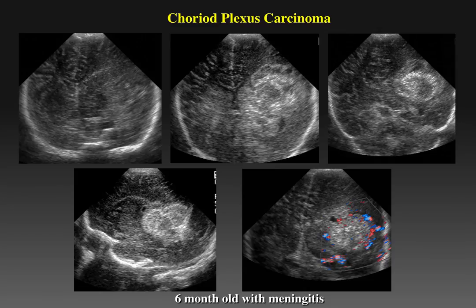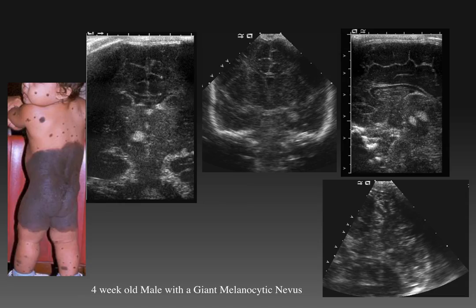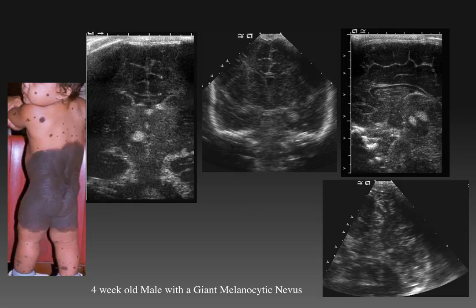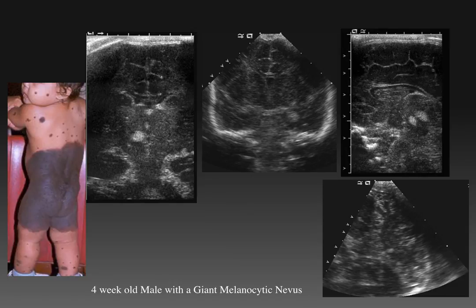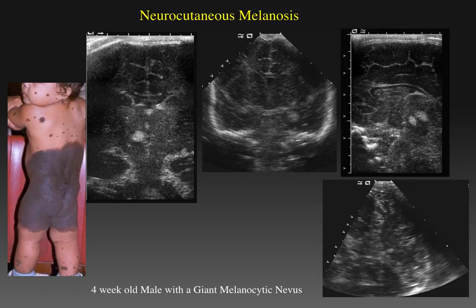These tumors are unusual, but at times difficult to separate from a clot without color Doppler sonography. Finally, we have a child with a giant melanocytic nevus in a bathing suit distribution. These infants may have congenital neurocutaneous melanosis in between 2% and 45% of patients. A small percentage of these infants will have the nevus degenerate into melanoma. In this child, we have multiple focal echogenic lesions throughout the posterior fossa and midbrain that were thought to represent neurocutaneous melanosis.